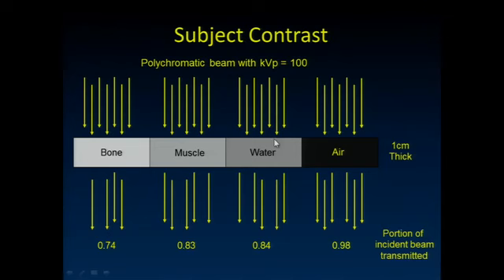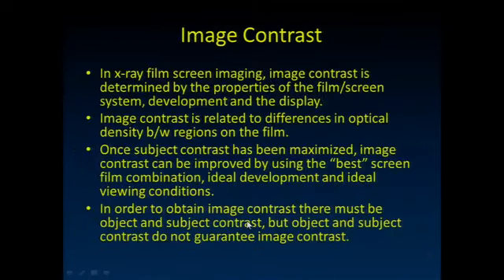As a matter of fact, if we went even higher, the amount through muscle and water would be basically identical. We would have no hope to differentiate them. This is the subject contrast, okay?